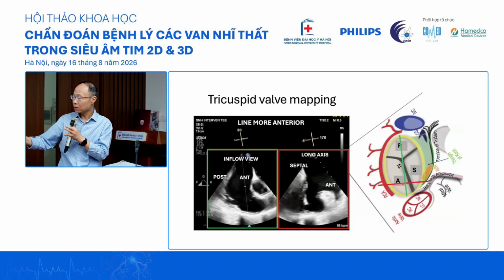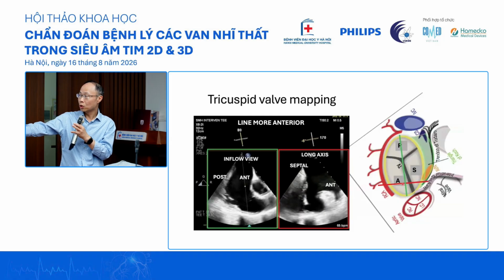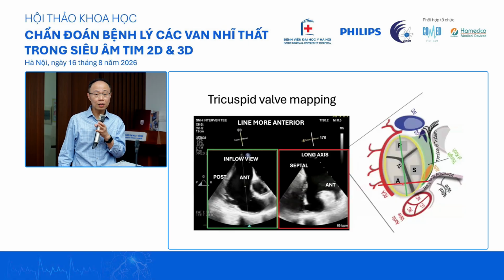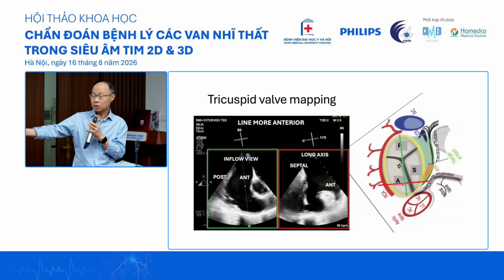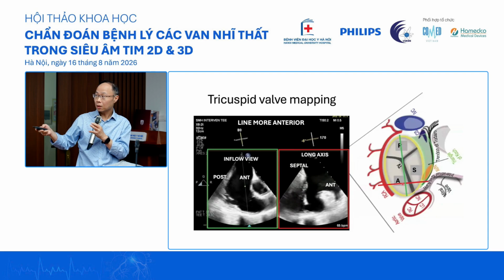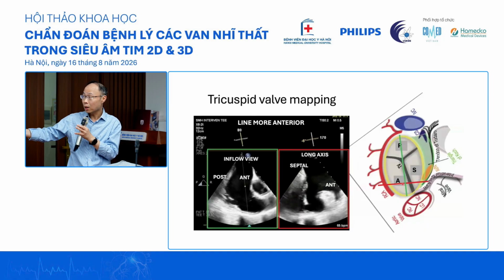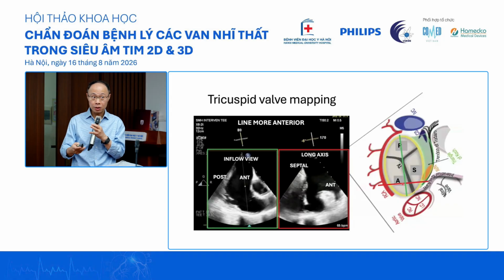And you can see that you need this view, you need this patient to have very clear transesophageal echo images. Again, if the left atrium is giant, the RV is a distant structure, we might not be able to see it. And for our own lab, that's one of the main reasons why we have to drop the patient from being considered for tricuspid clip, because you cannot see where you are. There's nothing to clip, because transesophageal echo is our eyes.